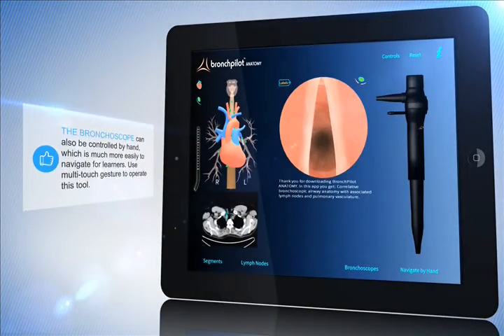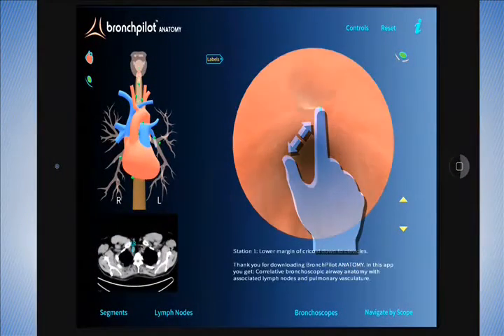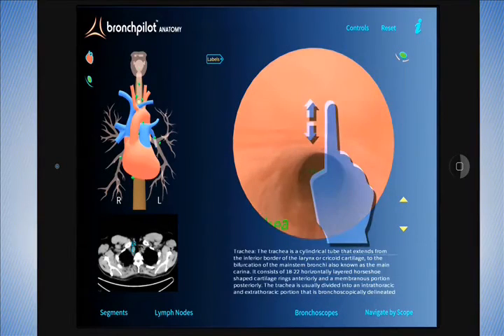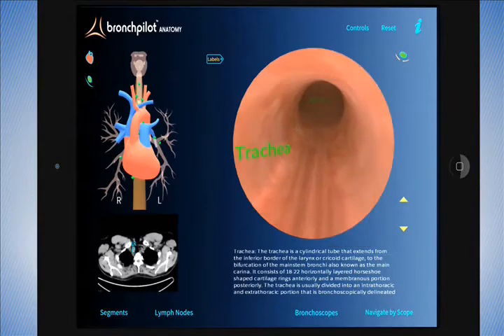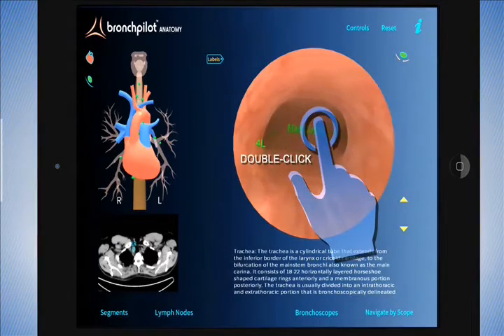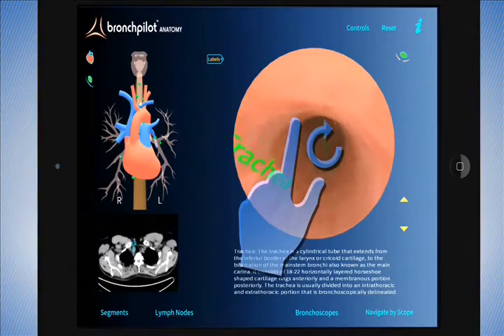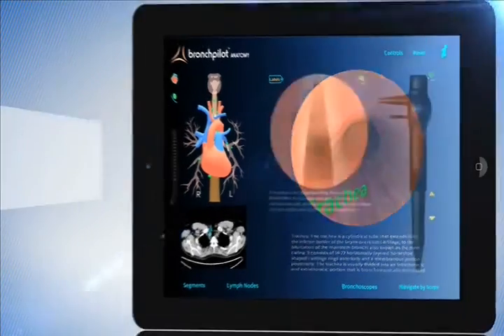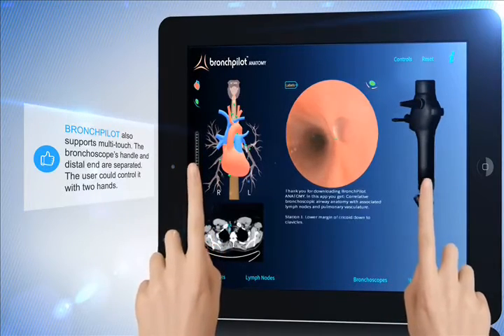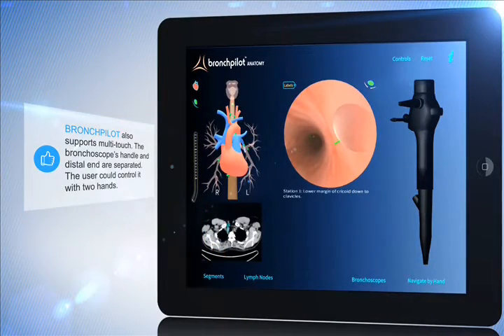The bronchoscope can be controlled by hand, which is much easier to navigate for learners. Use multi-touch gesture to operate this tool. Bronchpilot also supports multi-touch — the bronchoscope's handle and distal end are separated, so the user can control it with two hands.